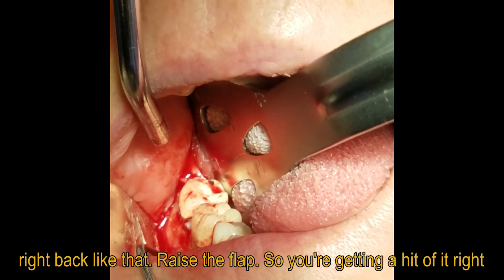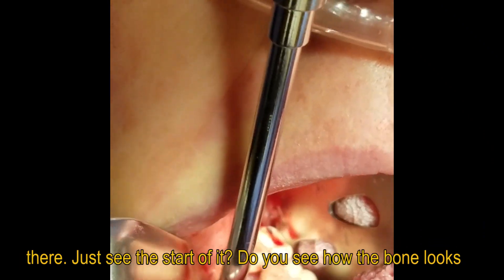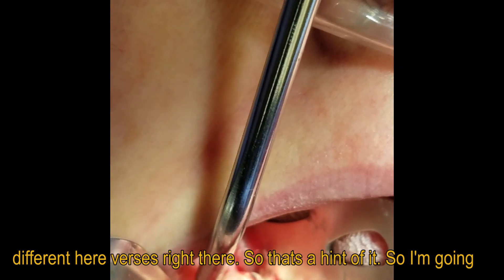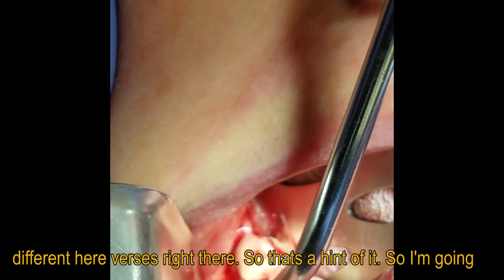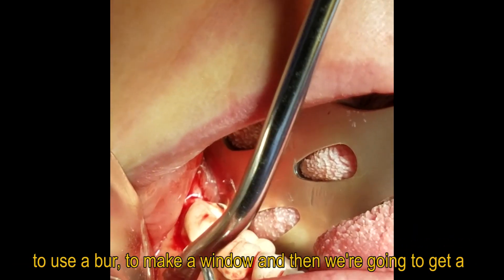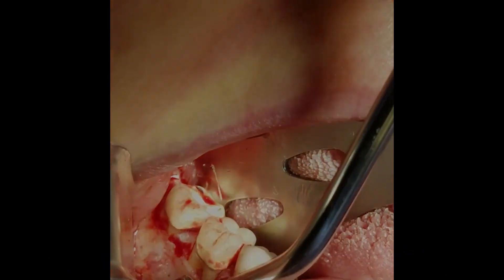Then you can just peel the gum right back — raise the flap. There's the cyst — you can see a hint of it right there. See how the bone looks different? That's a hint of it right there. So I'm going to use a bur to make a window, and then we're going to get a representative portion of that and do our biopsy.